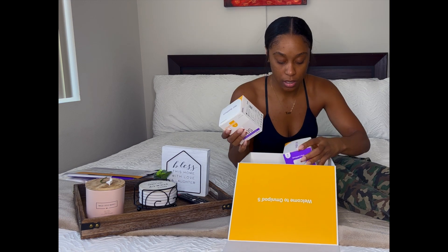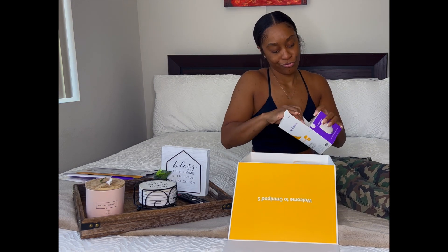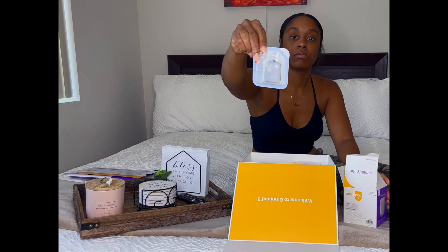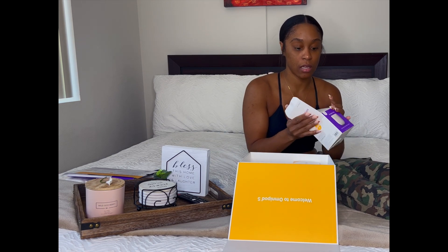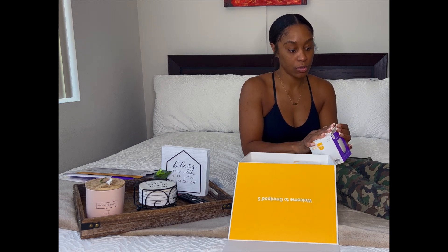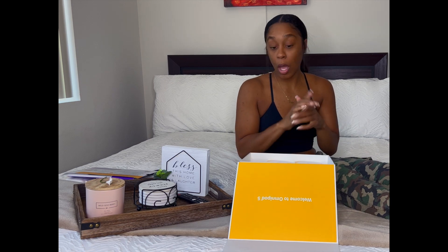It comes with 10 pods total — each box has five pods in there. If you've never seen a pod, it looks like this. I always recommend having two on you at all times because it can malfunction — it shouldn't, but sometimes it can — and if you don't have insulin with you, it's terrible.